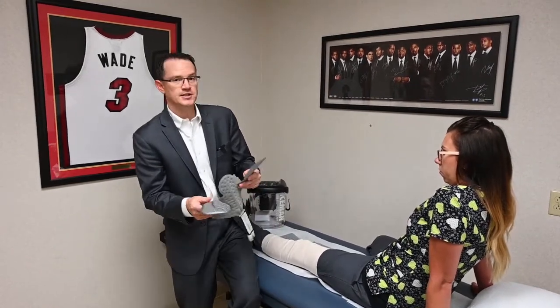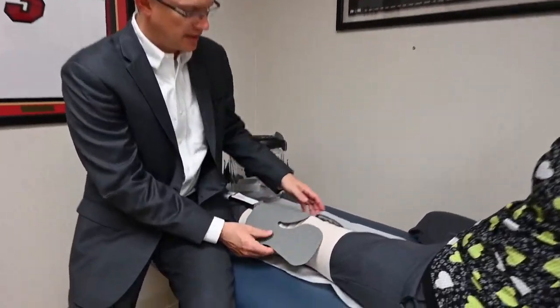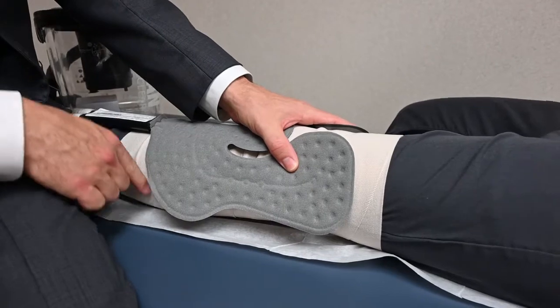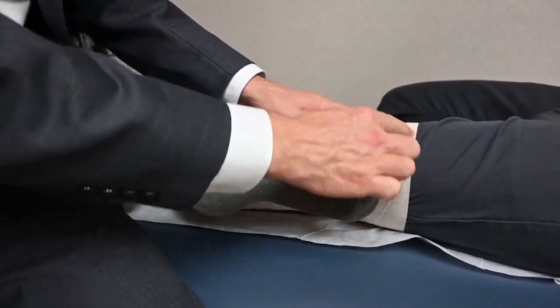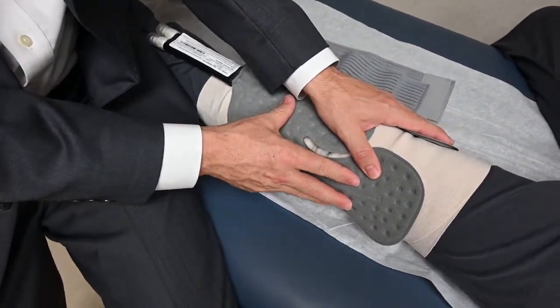The last reason is because of the polar care. When we place the polar care onto the knee, you want to ensure that all sides of the polar care are not touching the skin. In other words, you want to make sure that the ace wrap is under the polar care in all directions.